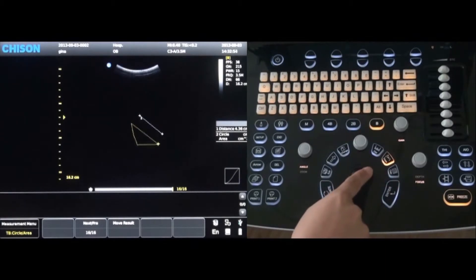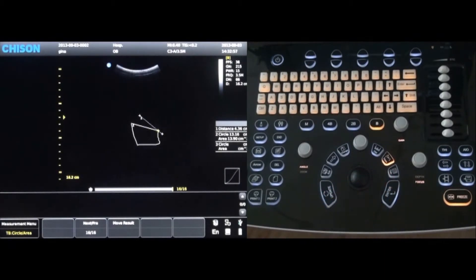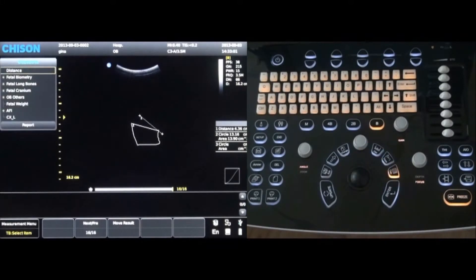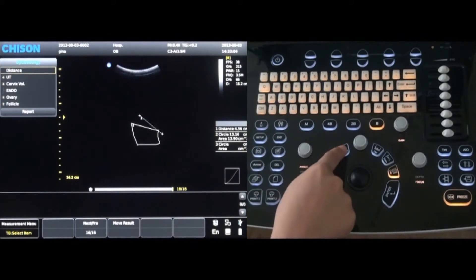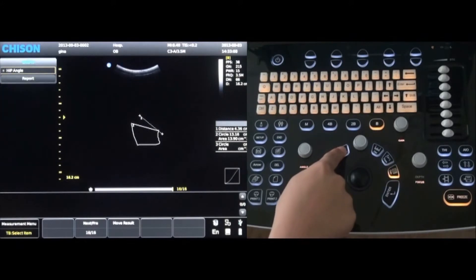To measure a certain area, use the trace key. Press enter to select the starting point and use the trackball to trace the area to measure. Press the enter key again to display the measurement of the traced area. Calculation packages can be selected by pressing the calculation key. Press the change key to cycle through the different packages and press the enter key to select the appropriate package.